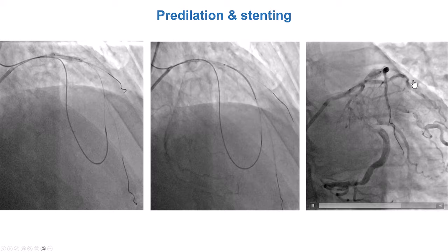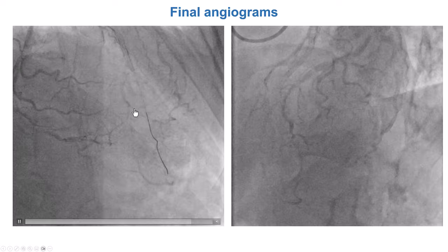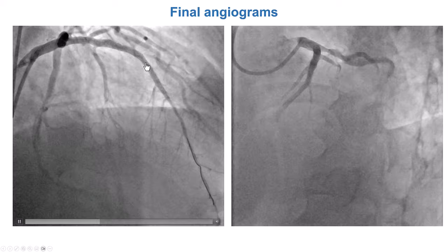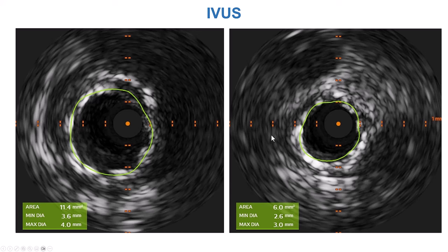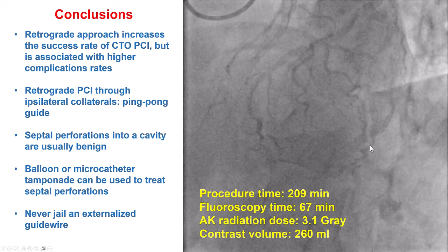This provided a nice result. We have essentially all the branches preserved — the diagonal at the distal cap, and a good bunch of septals. We performed intravascular ultrasound, which is especially important because of the calcification, and that seemed to improve the area of the vessel. So this was a nice final result.